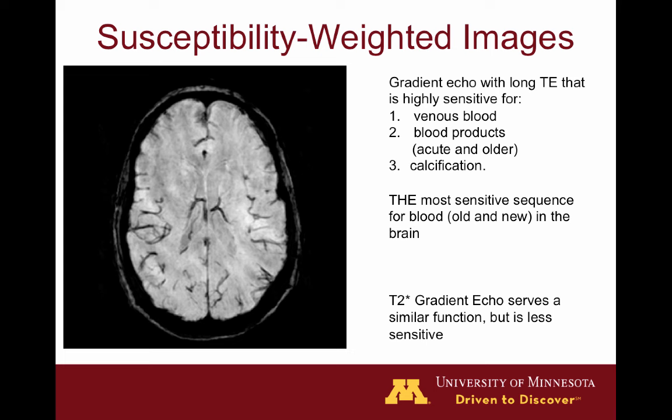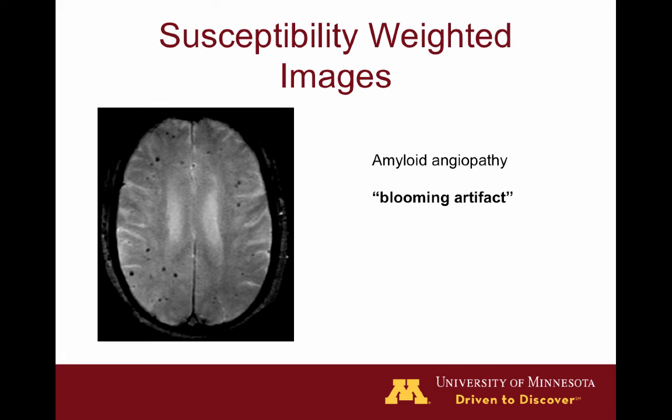Susceptibility-weighted images have been designed to accentuate any local perturbations in the magnetic field. This is especially useful for identifying small foci of calcification or microhemorrhage. Susceptibility-weighted images are fairly new, and T2-star-weighted gradient echo images are the older version of this sequence, showing slightly fewer abnormalities than SWI. Here's an example of a T2-star-weighted image showing multiple punctate foci of dark black signal through what we call blooming artifact, where the imaging abnormality appears larger than it really is.